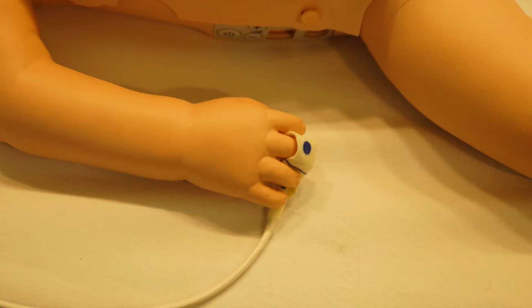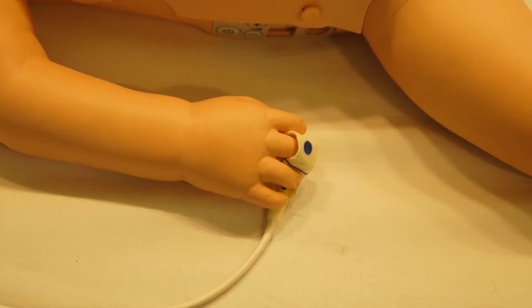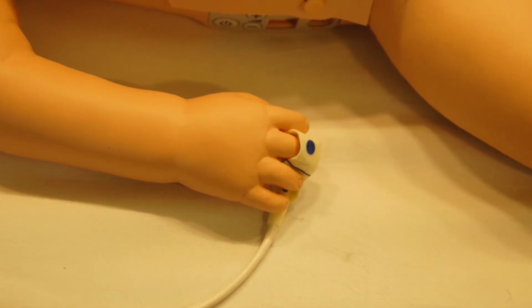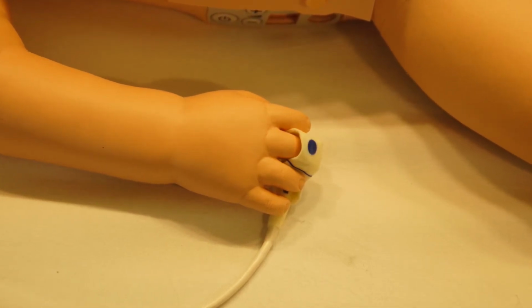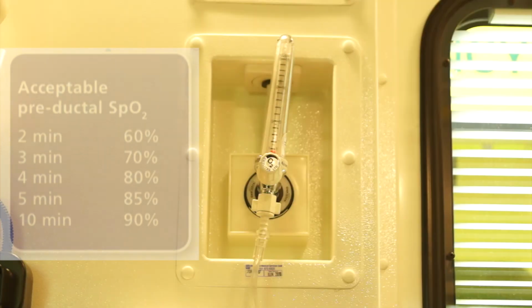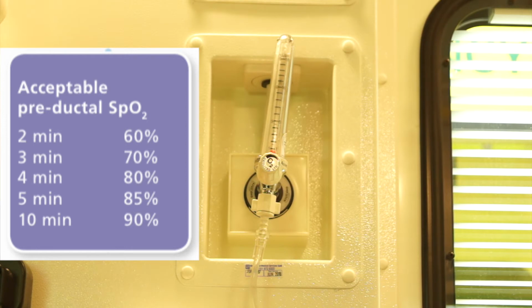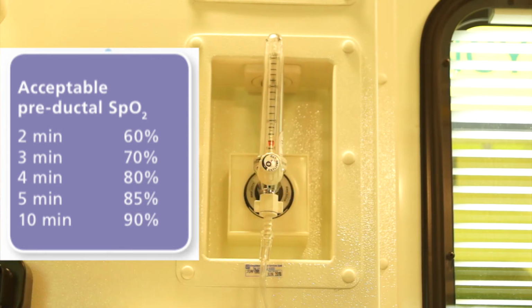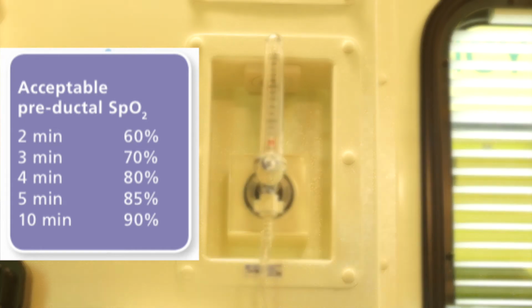After 30 seconds of ventilations and commencement of 3:1 resuscitation, consider preductal SpO2 readings by placing the sensor on a finger of the right hand. In order to achieve target saturations, introduce low-flow oxygen and reassess at timed intervals as per the algorithm.